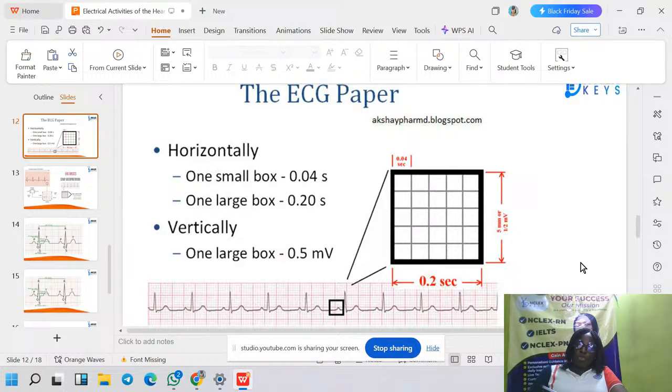What did I say you will do when you have this type of strip? Who remembers? What would you do? I said you will do something. Have we forgotten? When you have this type of strip that is more than 6 seconds, what did I tell you to do? Then for those that remember, which of the options is the closest to the answer?